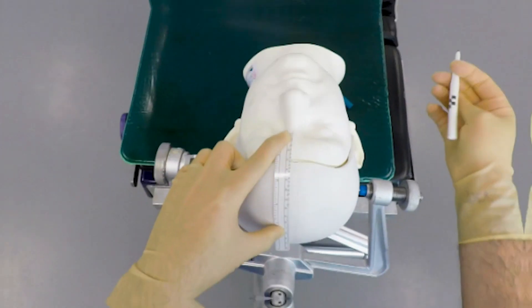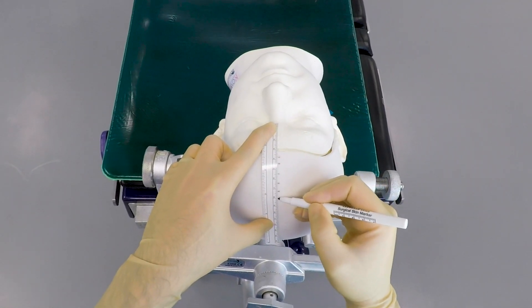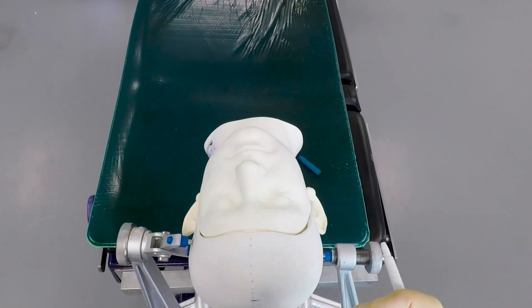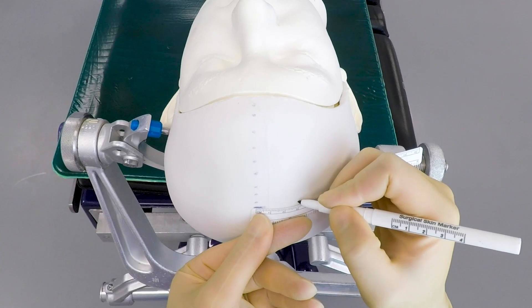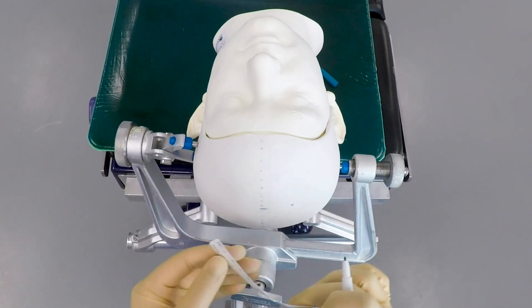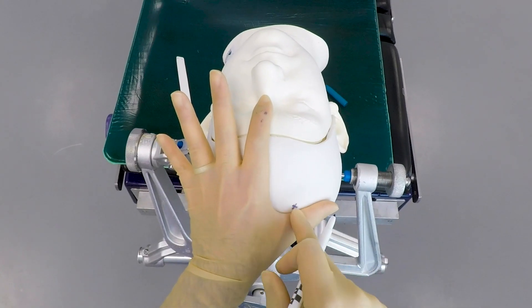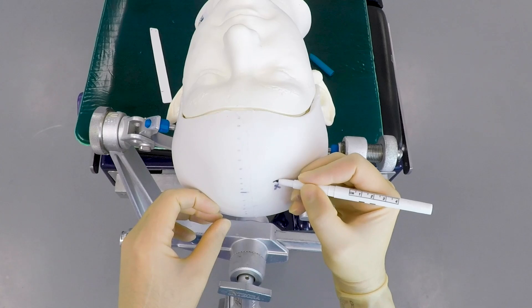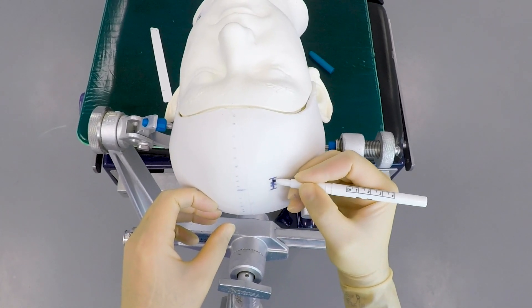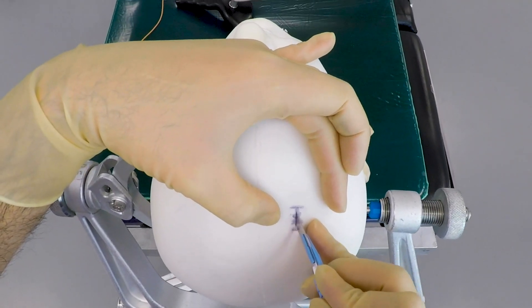So how do we do it? First, a neurosurgeon will mark out a safe place for the sensor to go into. We use anatomy to guide us and know where all the most critical structures are that we need to avoid. We mark out a specific point on the scalp that will usually be on the right side of the patient's head and away from the middle. This is so that we avoid the part of the brain that controls your arms and legs on the opposite side, and also to avoid going into any major draining veins in the brain.